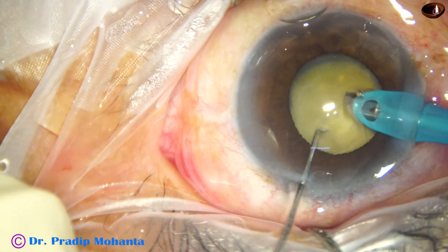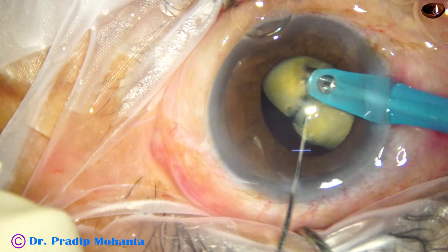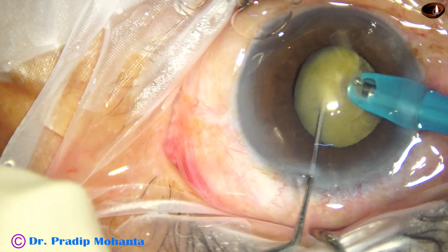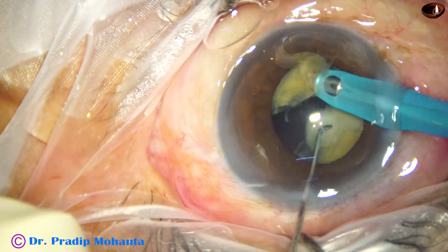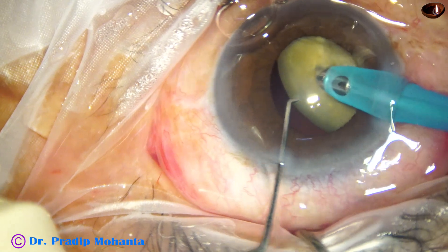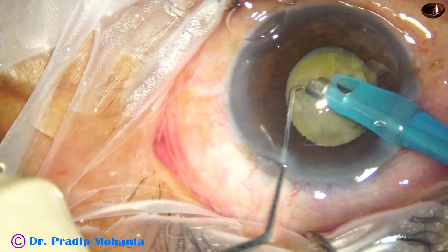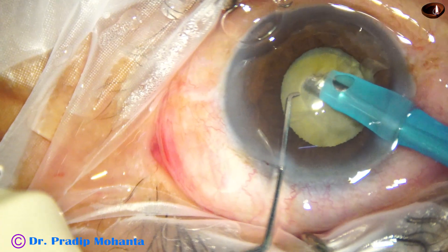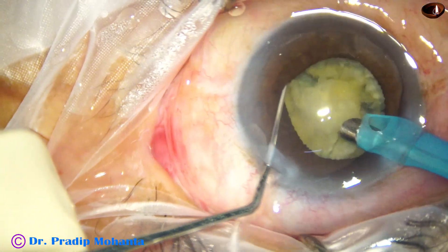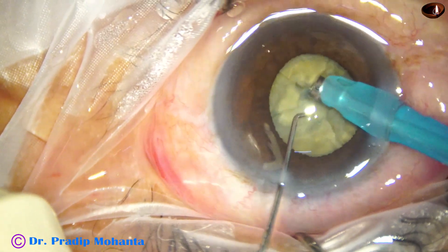The tip is buried in the substance of the nucleus. The nucleus is tilted a little bit. The chopper goes on the posterior surface. Between these two instruments, the nucleus is cracked. In this way, chopping of the nucleus is carried out. Going behind the other side of the nucleus, tilt it a little bit, crush between two instruments — it has to get cracked, it has no other option. And now the pieces are picked up and emulsification is carried out.